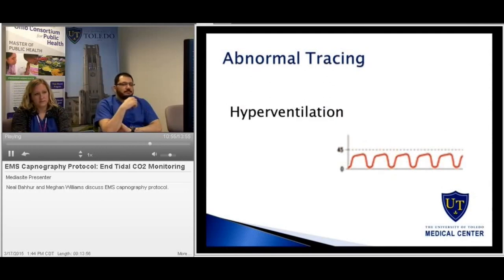This would be the opposite. The patient is either hyperventilating on their own due to impending respiratory problems, or the person bagging the patient is overdoing it and they need to back down.